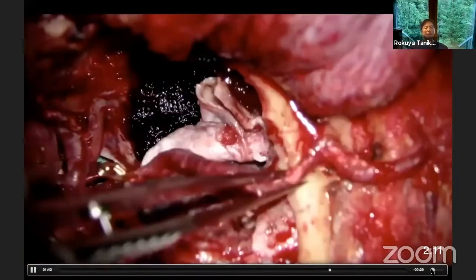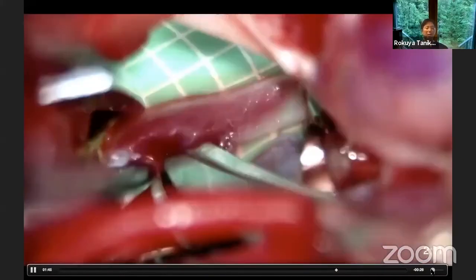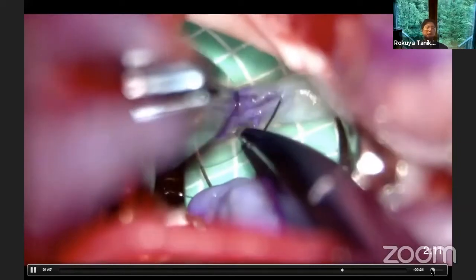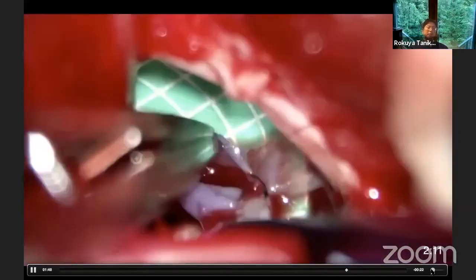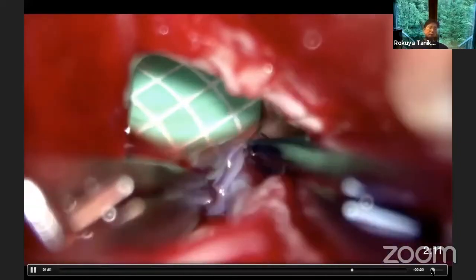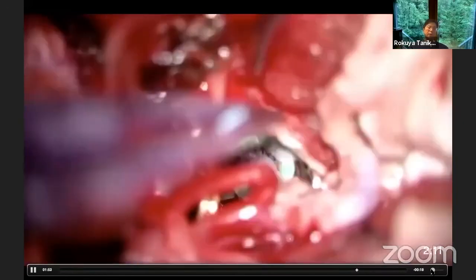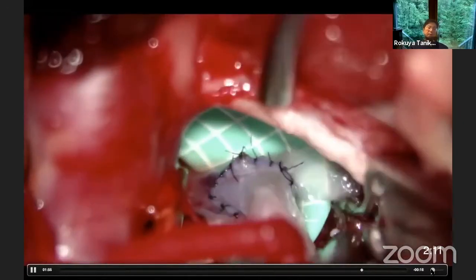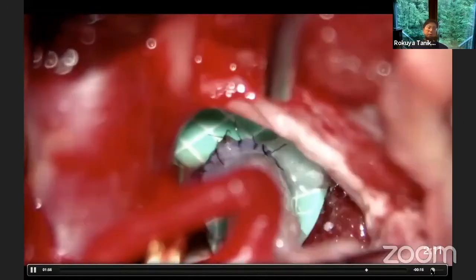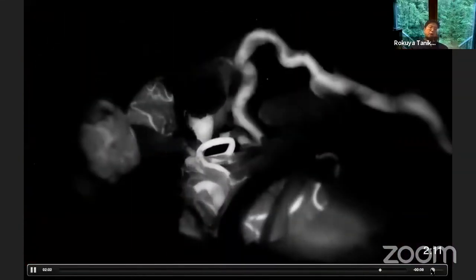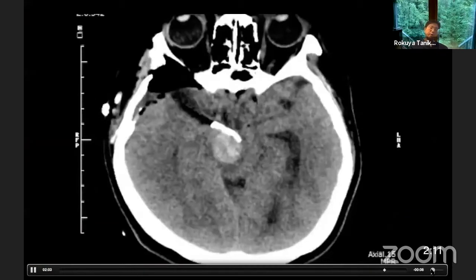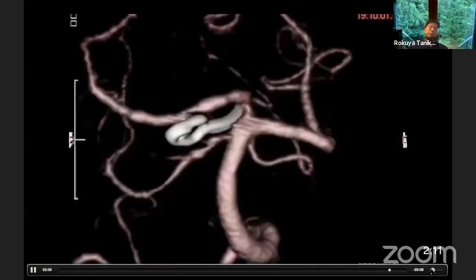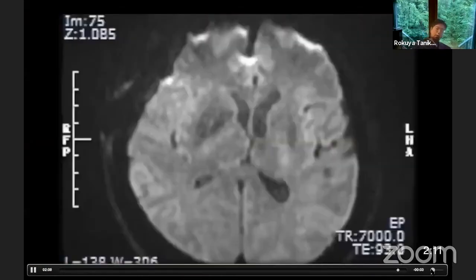So I decided to perform an additional STA-to-SCA bypass through the trans-sylvian route, just above the oculomotor nerve. ICG angiography shows very good patency of both bypass graft and good obliteration of the aneurysm. Fortunately, this patient had no ischemic complications and recovered well.